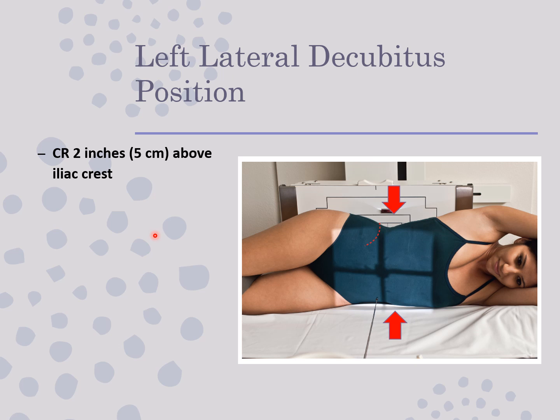And typically they order a left lateral decubitus, or we do that, because if the patient's lying on their left side, then if there was any free air, you would visualize that between the liver and the right hemidiaphragm. If they were laying on their right side, the problem becomes you could mistake free air with the gastric bubble, because air would rise if the left side was up. So typically a left lateral decube, if it's going to demonstrate any free air, it'll be found between the liver and the right hemidiaphragm.